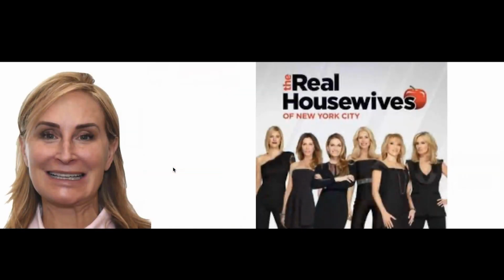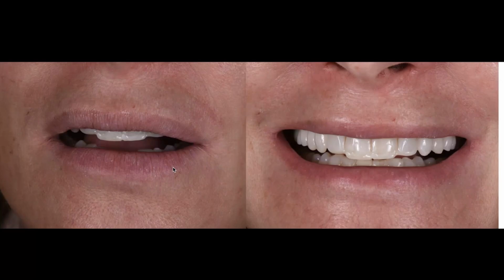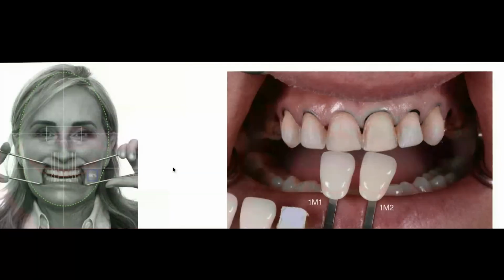So I'll leave you with one case because I think we're pretty close. Oh, I'm almost running late here, so let me run through this case quick. And nothing important with this case in the details except for the patient wanted the teeth longer. We went through a process to check how much longer we should make them. Doctor added a little composite in the mouth. We did all the normal evaluations, facial, where we want the teeth, all the same stuff that we would do.